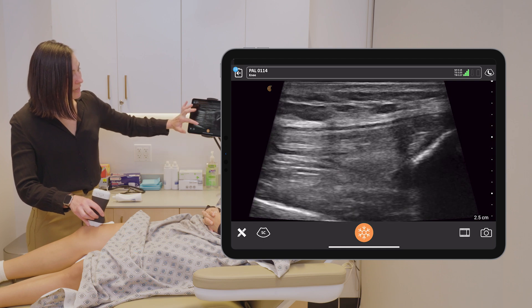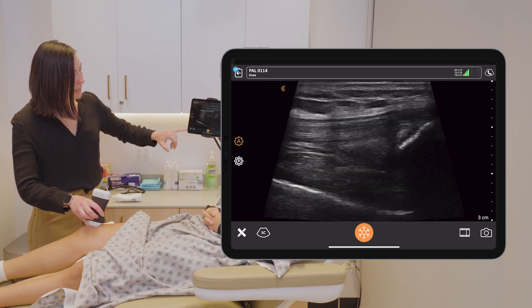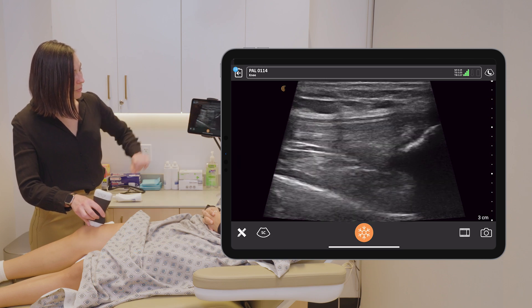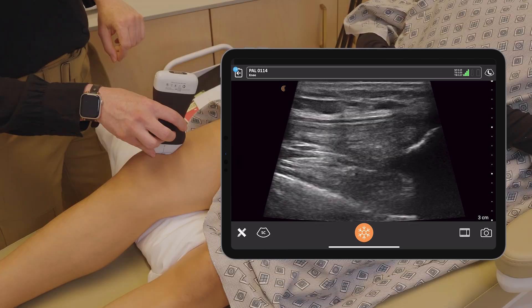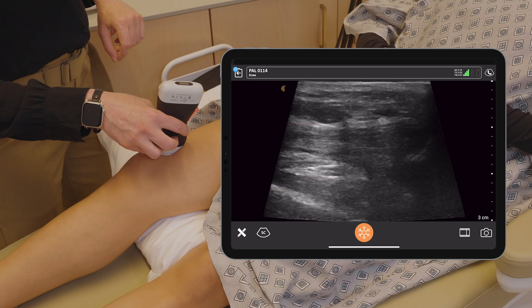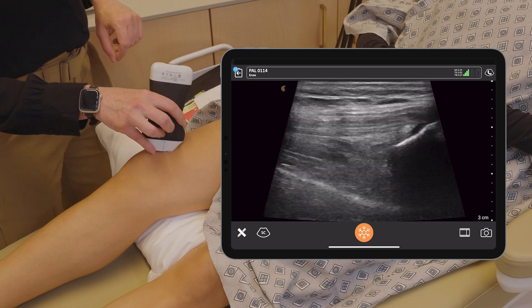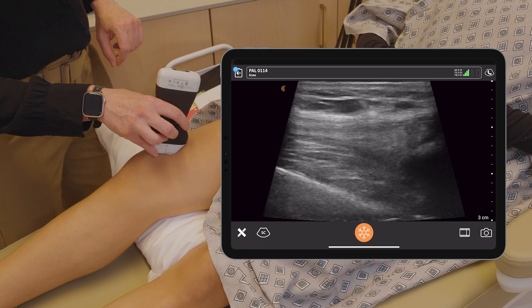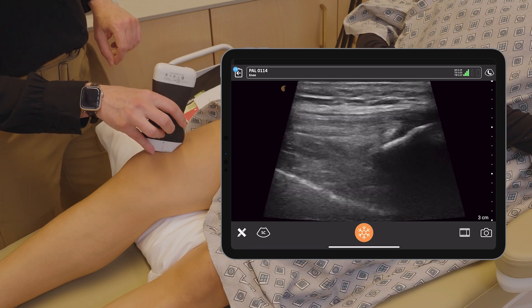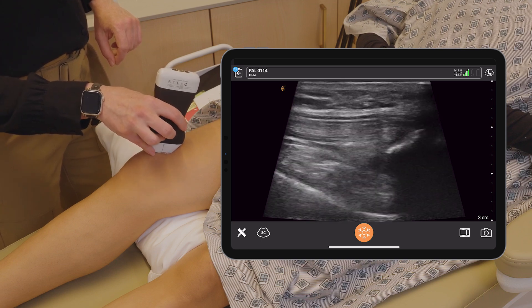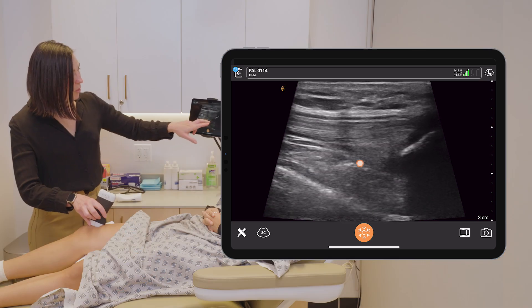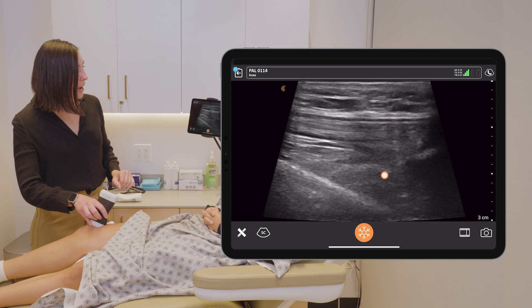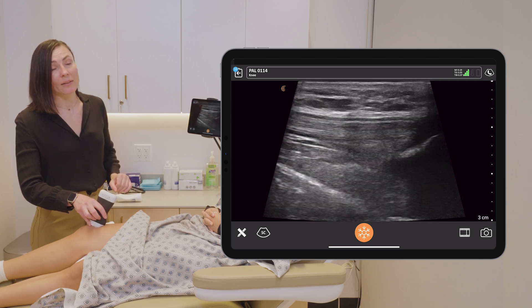I'm going to increase my depth a little bit so I can see the femur bone — you're seeing the contour of the bone at the bottom of the screen. Now I'm going to fan through the area to see whether I can identify anechoic fluid. This region is called the suprapatellar recess, and it's a potential space where knee effusion can collect.